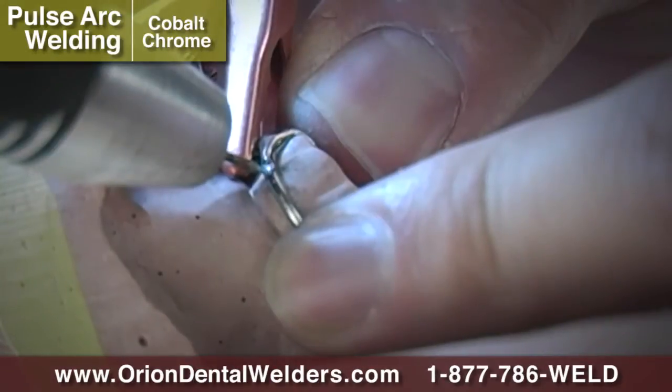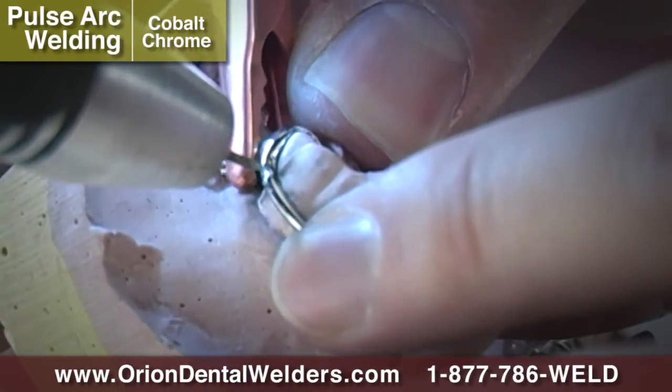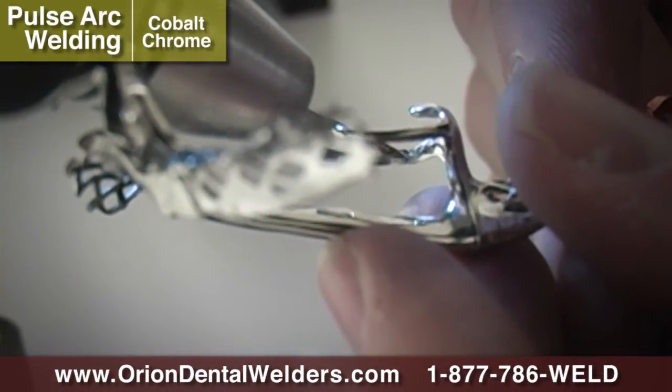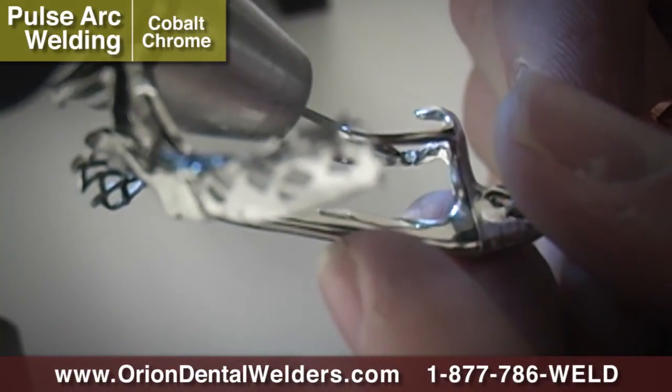Place the clasp in the appropriate position and use Micro Pulse Arc Mode. After removing the partial from the model, weld the inside of the clasp joint for additional strength.